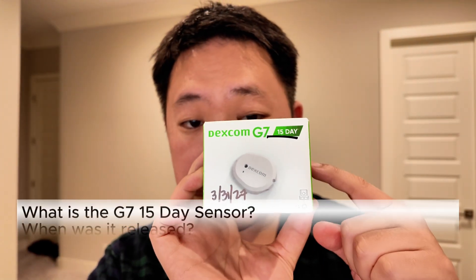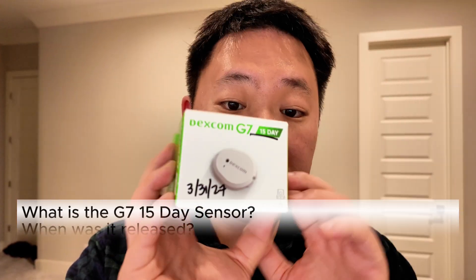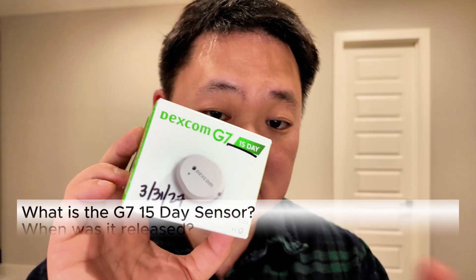The 15-day product is a different sensor than the 10-day version, but it looks visually identical and it has a very similar looking box. Like the G7 10-day, it does have a 12-hour grace period, so it's technically a 15 and a half day sensor.